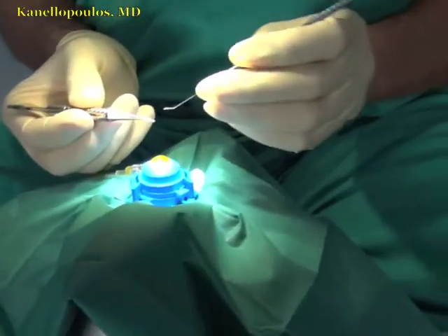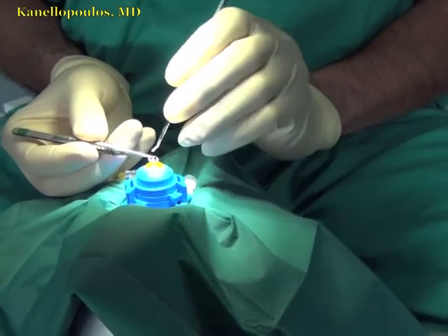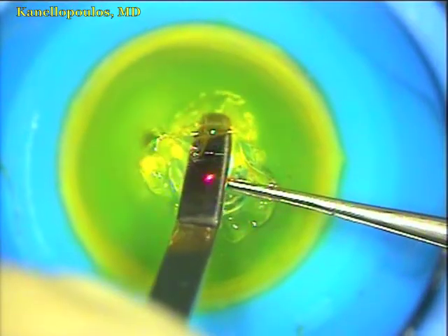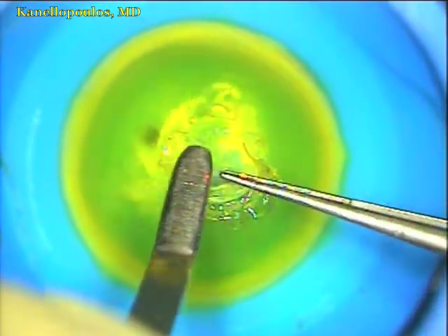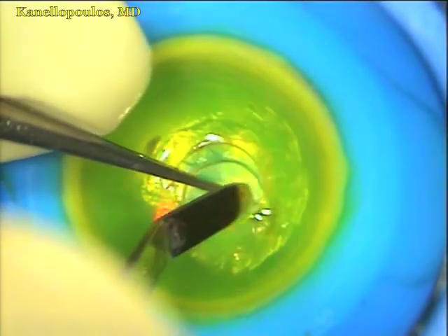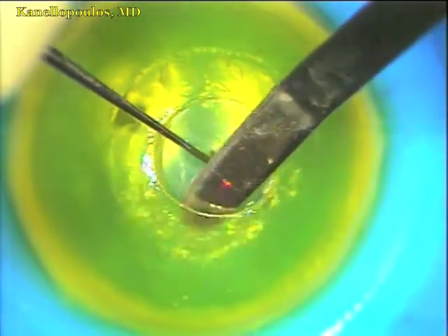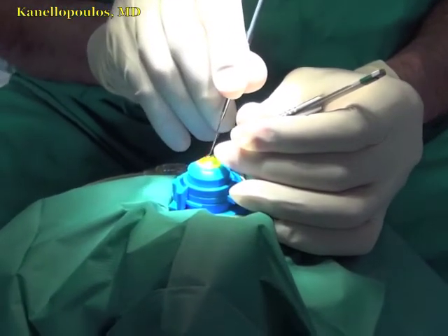Here you see how easily the lenticule is being removed — excellent surgical planes. We'll switch microscopes. We're working now on the EX500 microscope, so you can see the keratoprosthesis being implanted through the cornea opening, using a blunt spatula to stretch out the haptics with 12 fenestrations. This is the newer model keratoprosthesis. First surgery, as I mentioned, here in Athens, October 22, 2013.